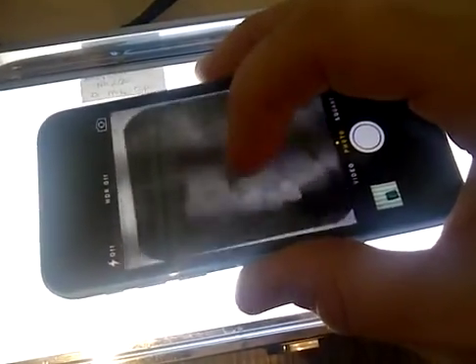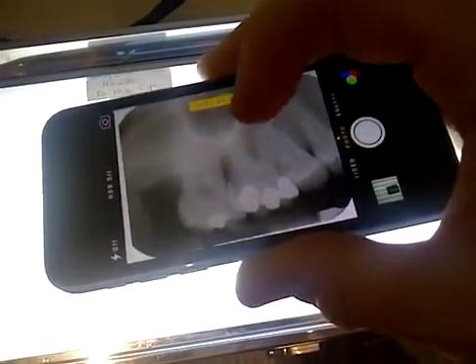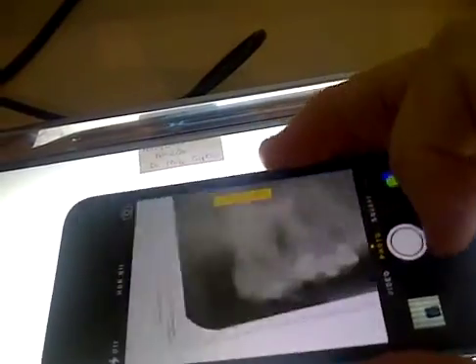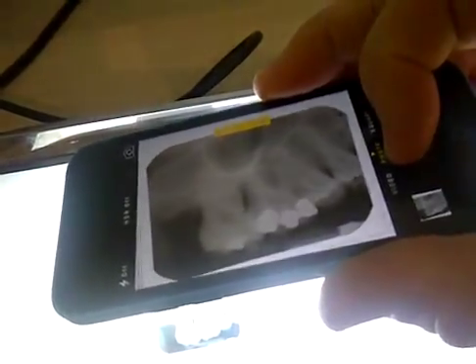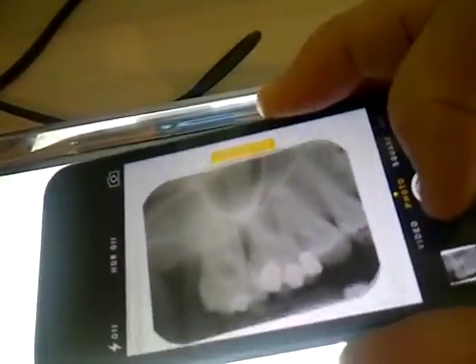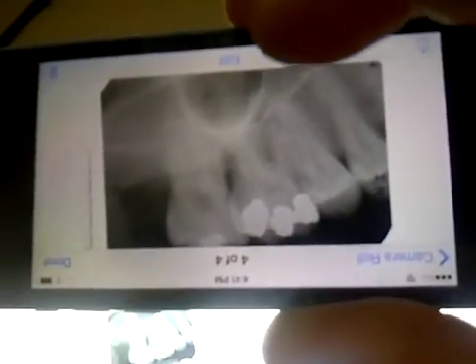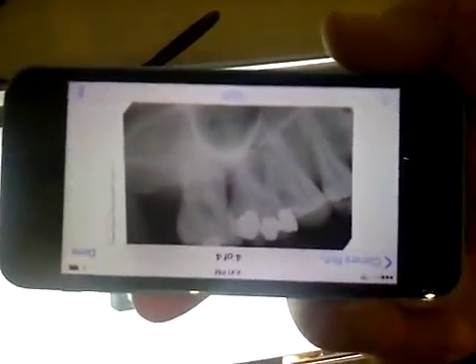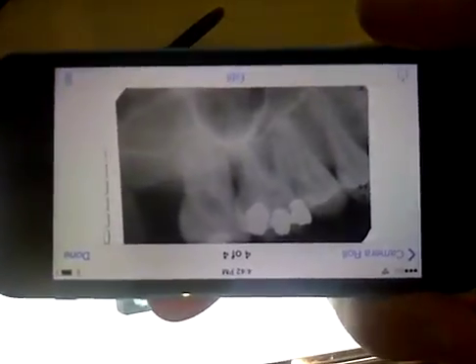Once you get it lined up, hold down the button so that it focuses. Look what happens — the image clears up significantly once it establishes the right depth. Then you take the picture. Totally different results. Once you get into the iPhone settings, zoom in, change to mono mode, and make sure you press down to get that focus lock, otherwise you'll get those bands showing up.